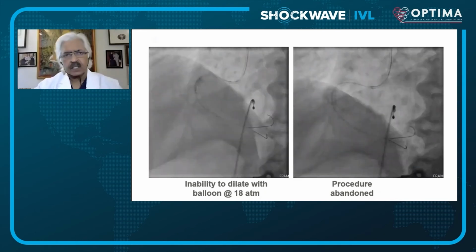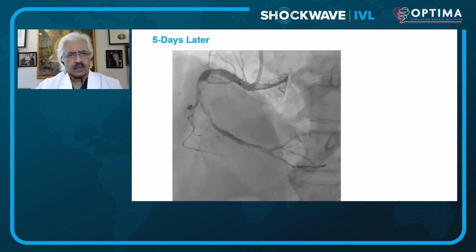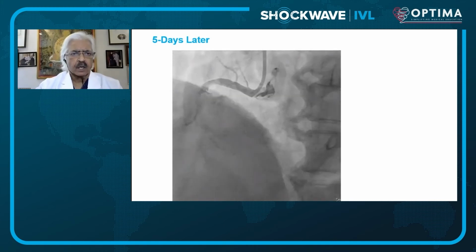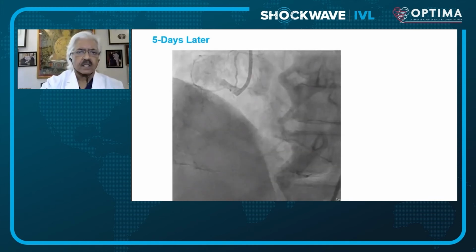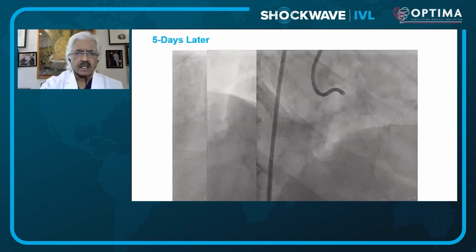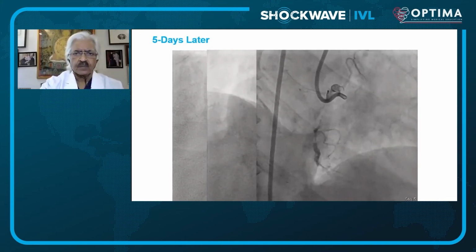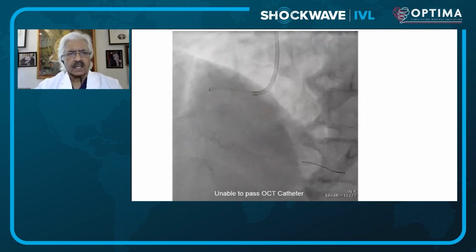Of course, the patient continues to have chest pain and presents to me 5 days later, and you can see there is poor guide catheter support, and apart from that high-grade calcified lesion proximally, there's thrombus in that vessel. The AL1 guide is certainly not coaxial and would not allow rotational atherectomy in this instance. I proceed then to a Judkins guide with a guide liner.